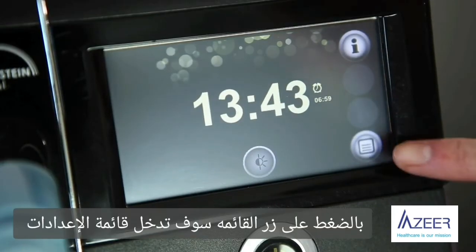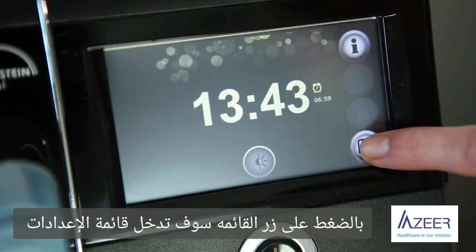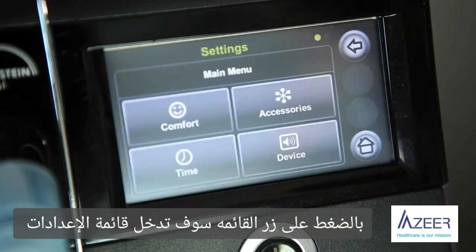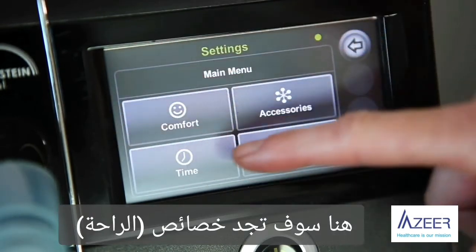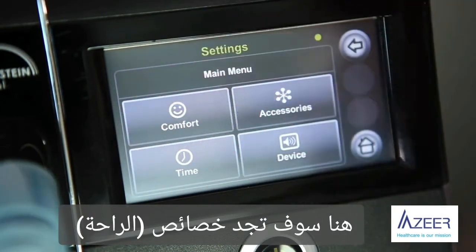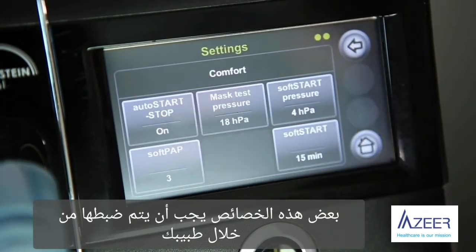By pressing the menu key, you will enter the setting menu. Here you will find the comfort features. Some of these comfort features have to be activated by your dealer or your doctor.